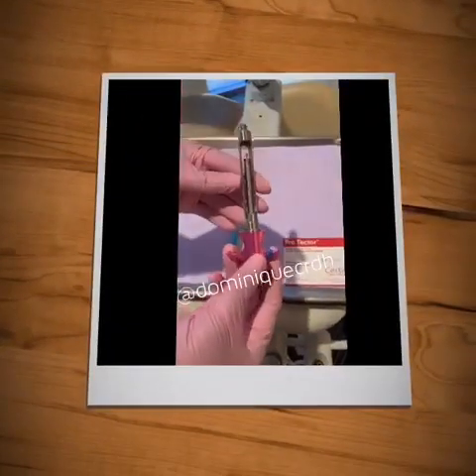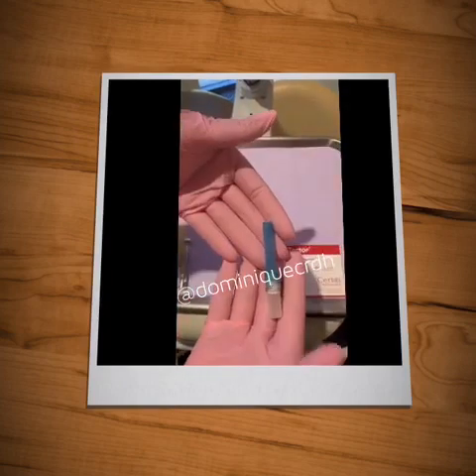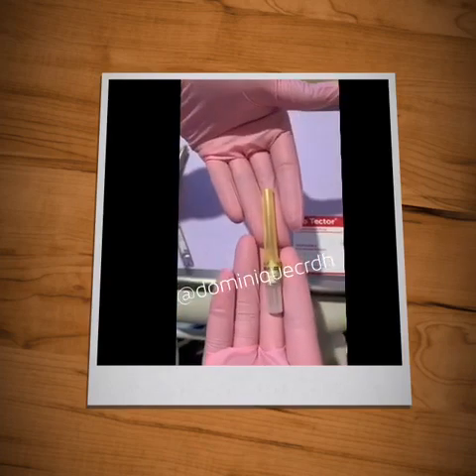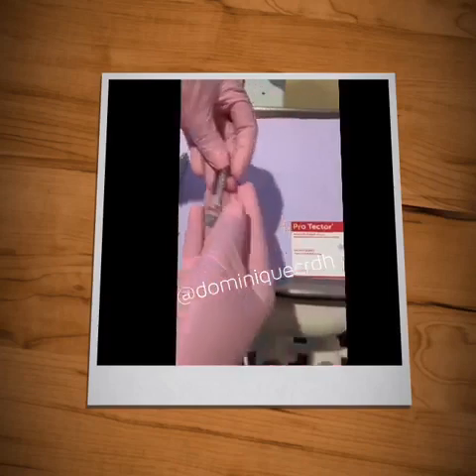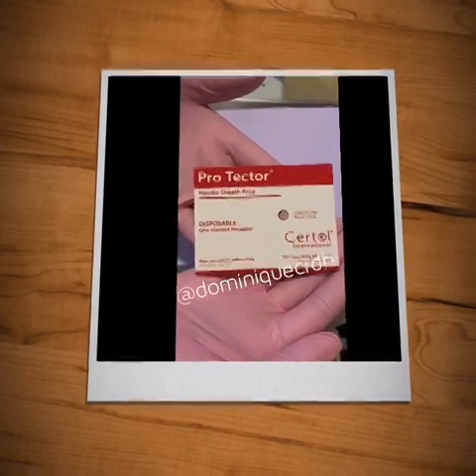Instruments needed are the syringe, our needles. The first one is a short needle, and I typically use a 30 gauge. The second one is a long needle, and that's used for our IA blocks and our lingual blocks. Third is the carpule of anesthetic. And our fourth thing that's most important is our protector shield, and this is to avoid needle sticks.